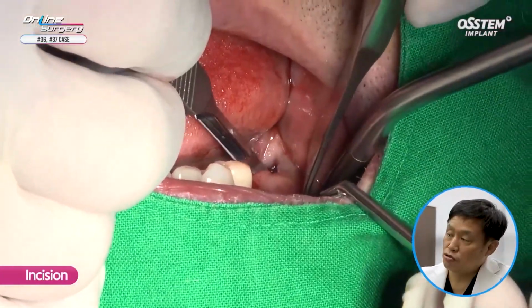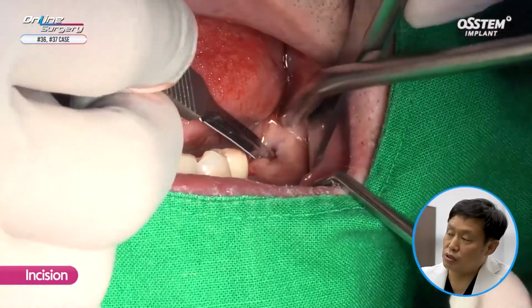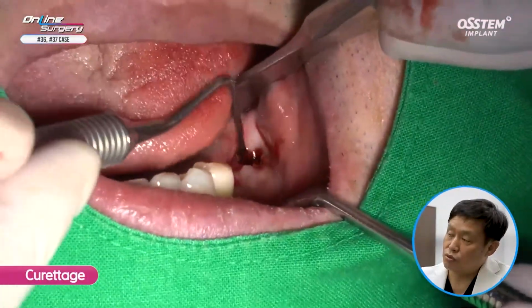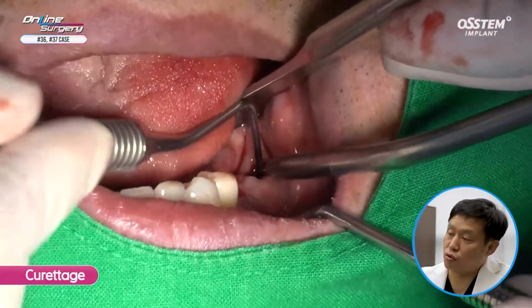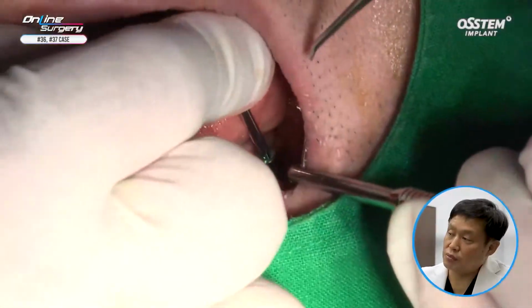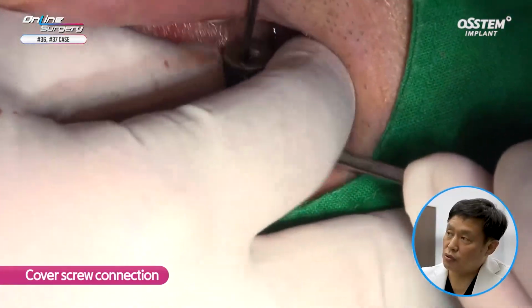As mentioned earlier, the distal side of the extraction socket, the thread was slightly exposed. Incision was made to do GBR, and granulation tissue on the superior side is removed. Cover screw is connected first.